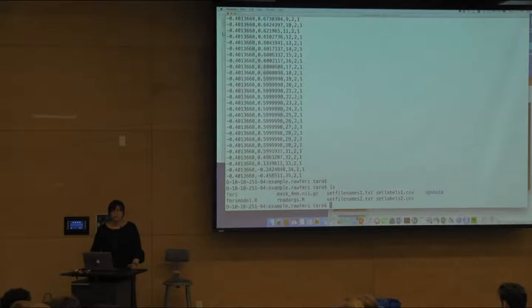So you have some sort of stimulus in a block design, and it's either on or it's off, and then you convolve those with the hemodynamic response. So that's all that is. It's just the task design for the simulated experiment. So just like we saw for EV1, EV2 in the fMRI thing, it's the same idea.